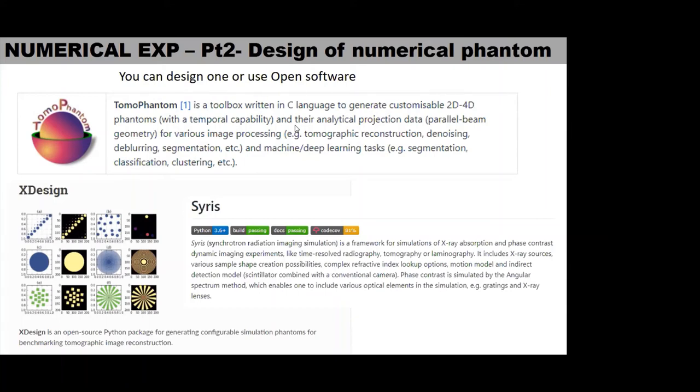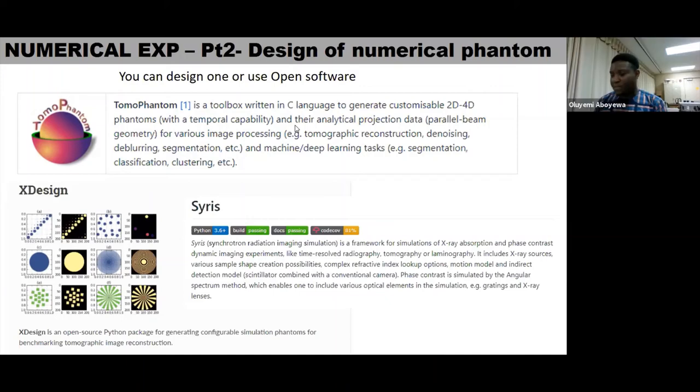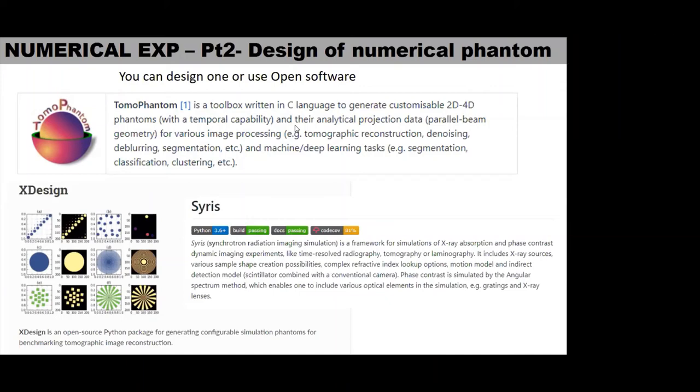Okay, because I'm just thinking, if we're saying dual energy CT is good for differentiating between materials or tissue that have the same CT number, yes. I'm just thinking, I don't know if it's in PET now, where they do this kind of dose painting, in a particular tumor you could have different cancer cells that have different radiosensitivity. Some could be more hypoxic than others.